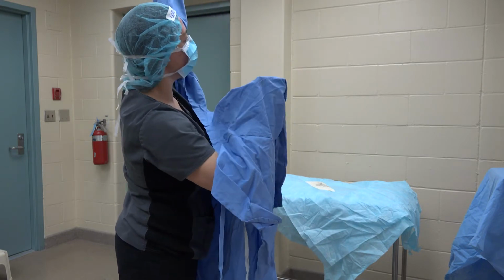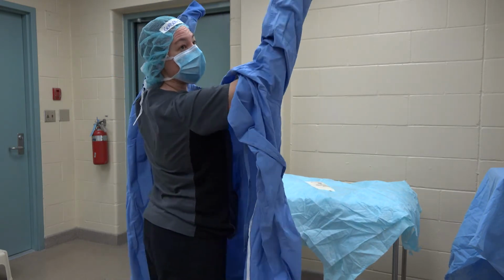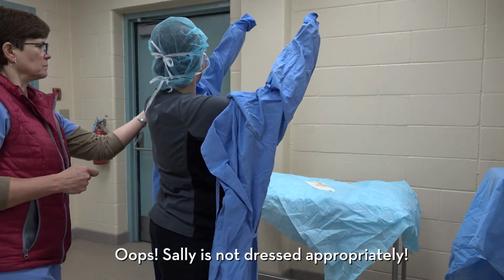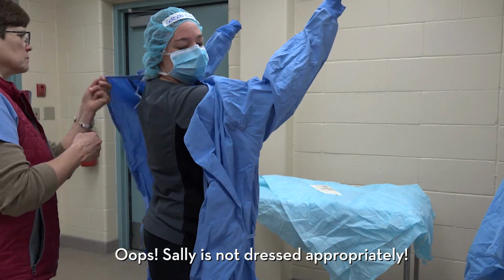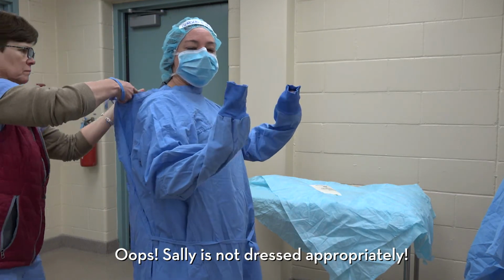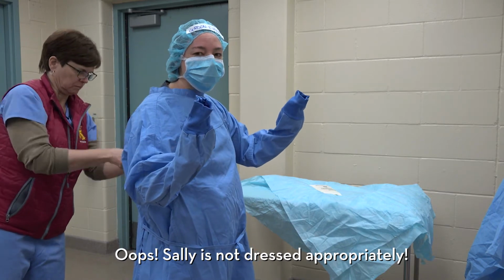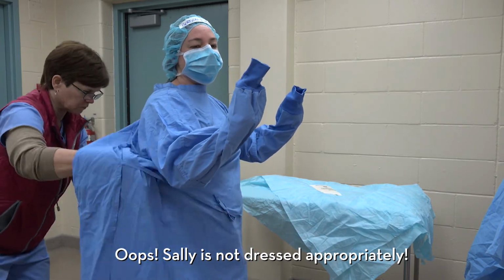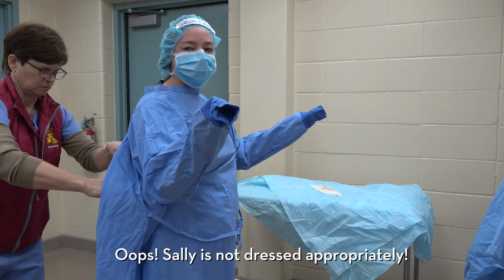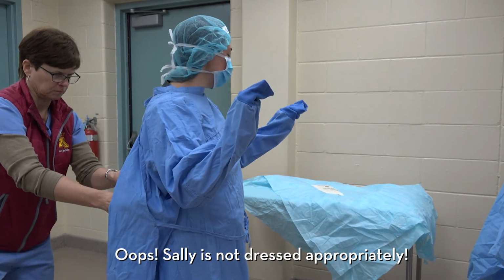And my arms are going in high. I'm looking above me to make sure I'm not hitting any of the drop downs or lights or any of those kind of things. And then Sally over here is going to tie me in, which makes gloving much easier. You also notice my fingers did not come out. Why? Because my fingers are clean, but they are not sterile. So I do not want to touch anything with my fingers. I'm only going to touch stuff with my sterile sleeves.